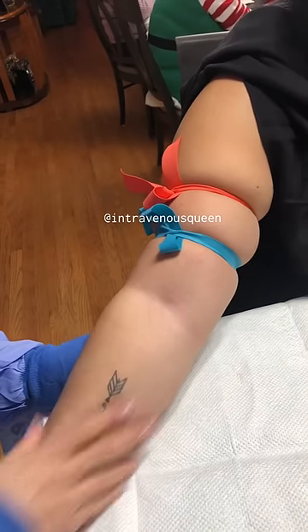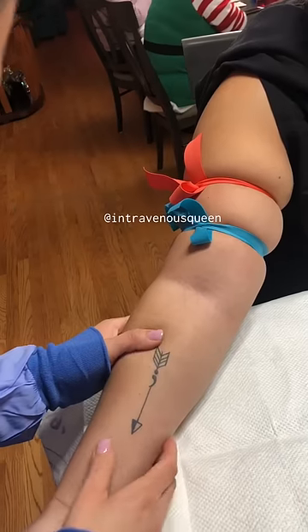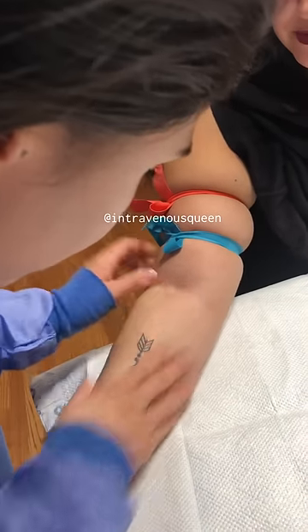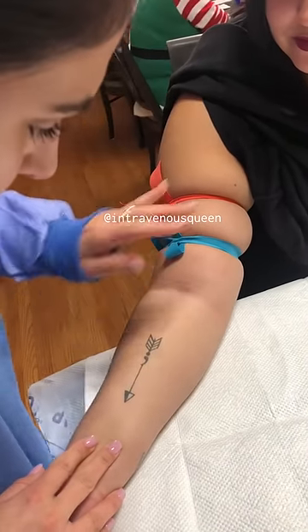For starters, I always feel for veins with clean and gloveless hands. Additionally, as some of you also know, I'm a huge fan of my double tourniquet technique.